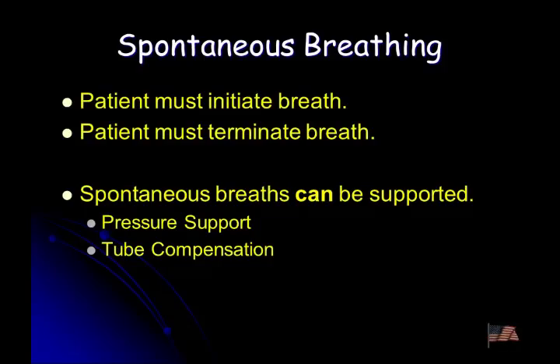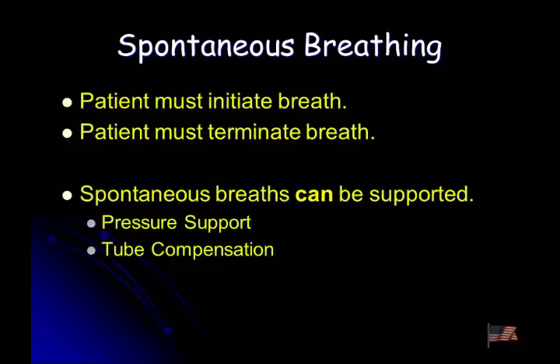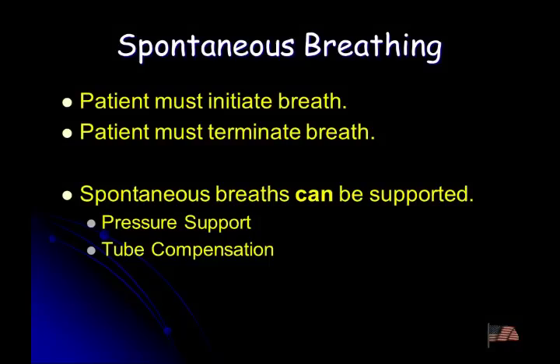Those spontaneous breaths can be supported or unsupported. Supported meaning I give it a boost. So when we talked about non-invasive ventilation, we were talking about those situations where I created a delta, a pressure support to augment tidal volume. But that's still a spontaneous breath because the patient's in control of starting and ending it.